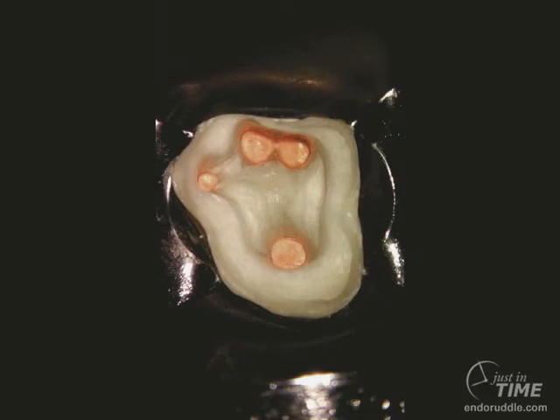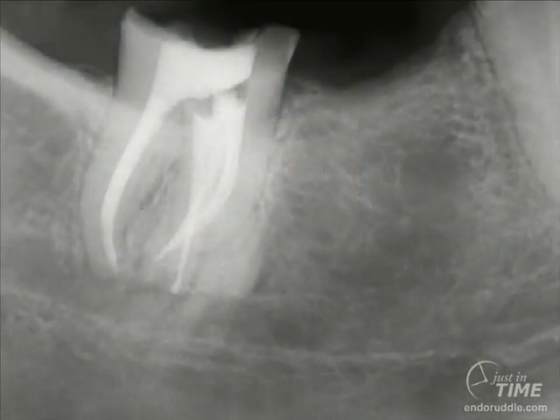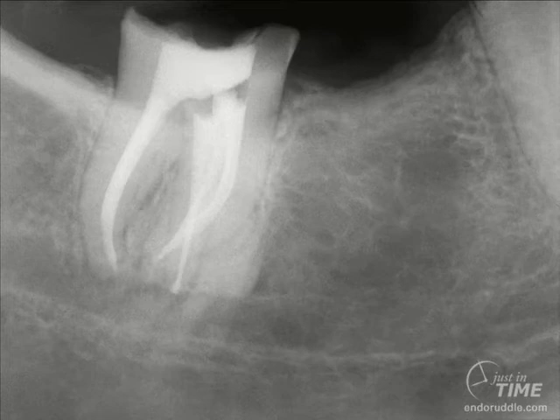You can see the pulpal floor has four orifices. On the post-op film, you can see that the ML2 had its own root and its own canal within that root. It would have been sobering if we'd approached this case surgically — that ML2 is a long ways from the buccal cortical plate, and surgery would be complicated by proximity to the neurovascular bundle.